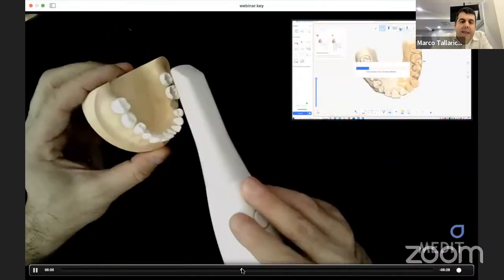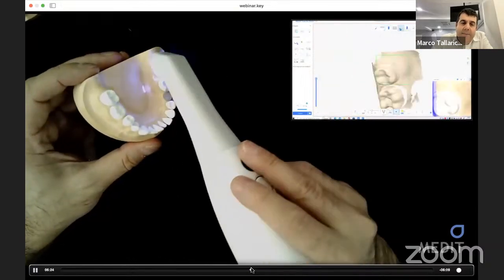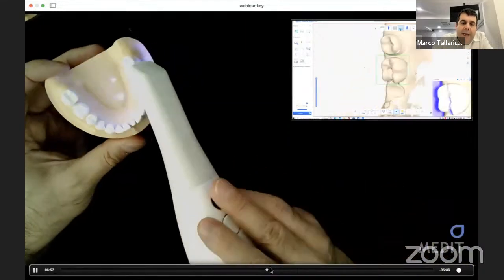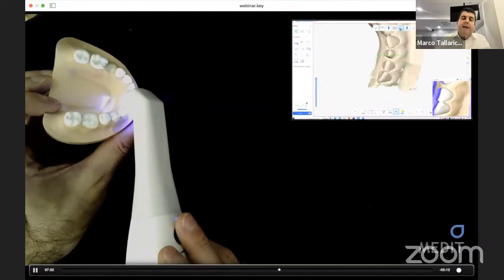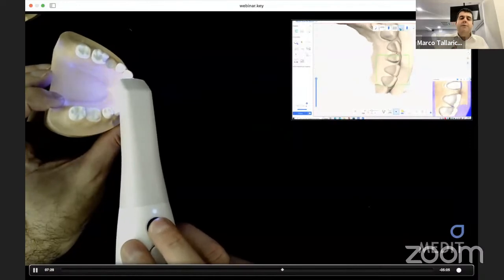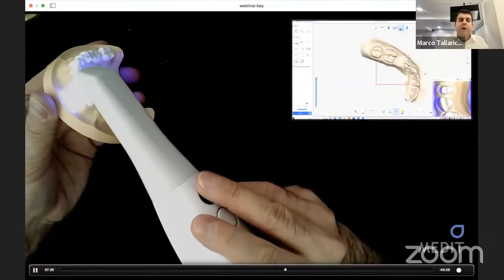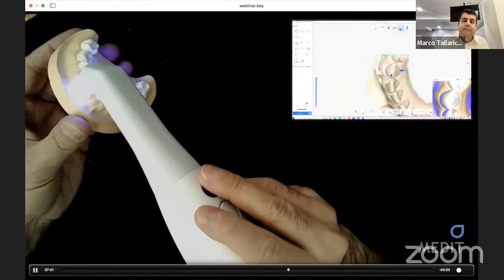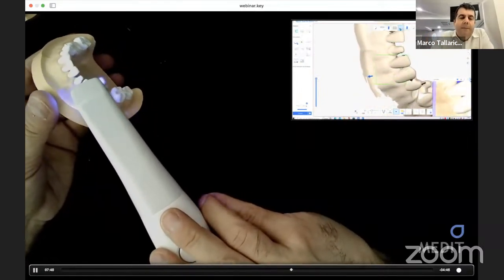I go quickly. In the mandible, I will go quickly because the strategy technique is the same: occlusal surface of the molar, coming back on the canine, lingual, and buccal area. Then zigzag in the incisal area. In the mandible, I suggest to stop the scanner to make you comfortable and to start again to collect the second area. When you collect the second area, you can start on the previously acquired area, or you can start on the molar area. And then the software will apply the stitching tools.